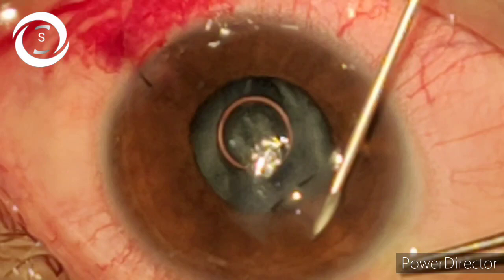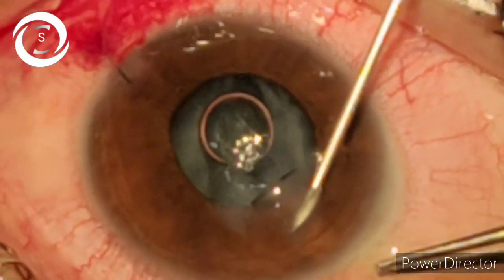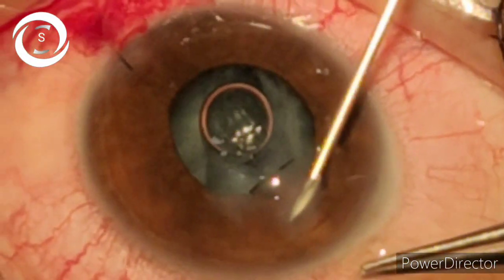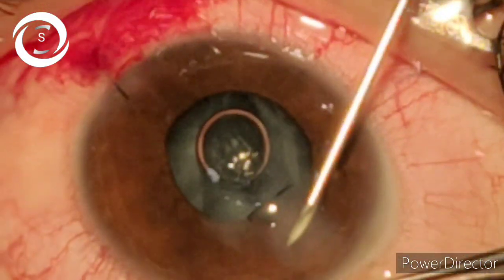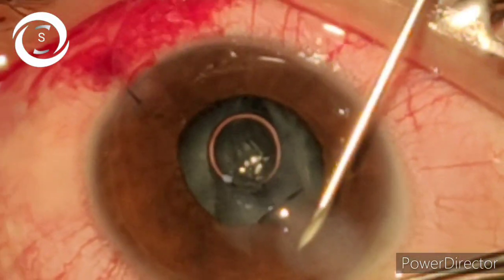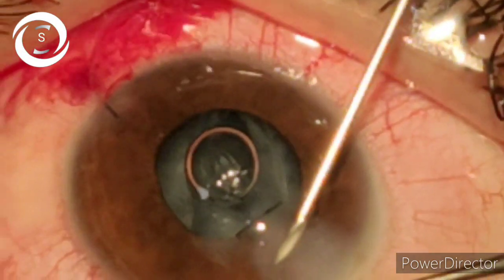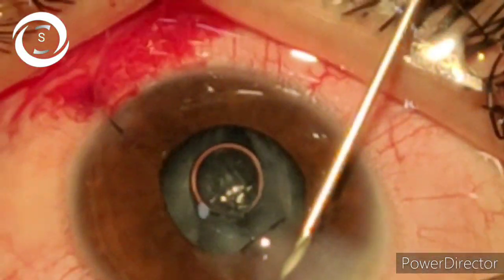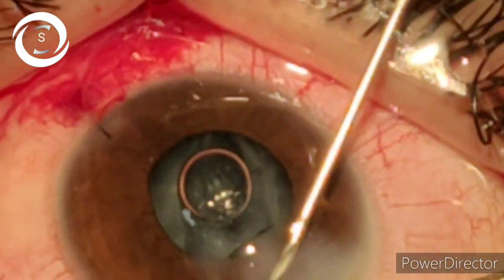Here you can see how to inject antifungal intrastromally. You can see the cornea become hazy when the antifungal fluid is injected. So that's enough.